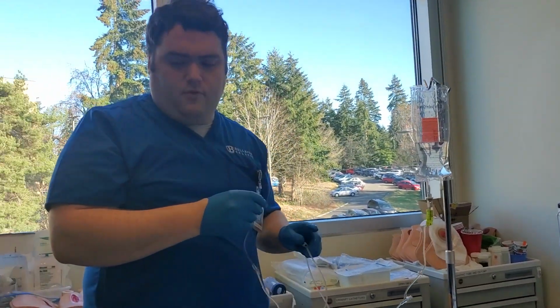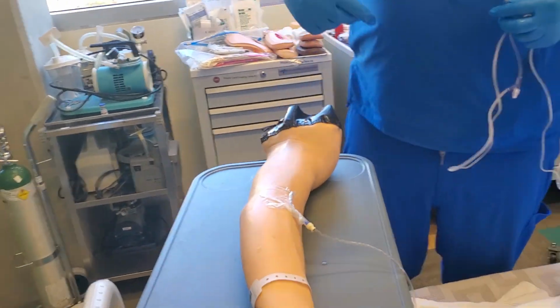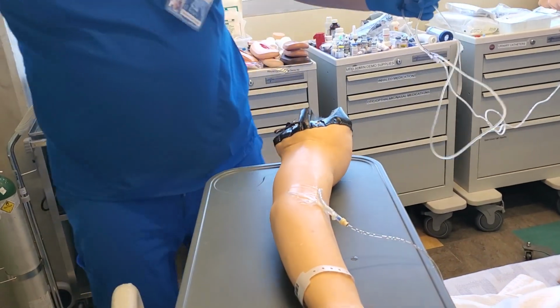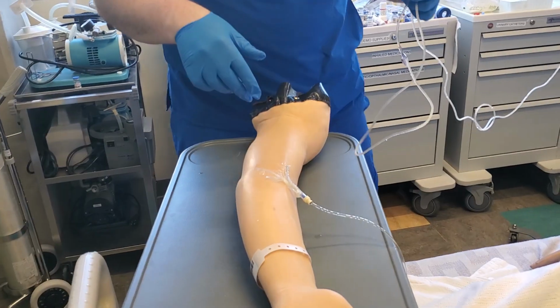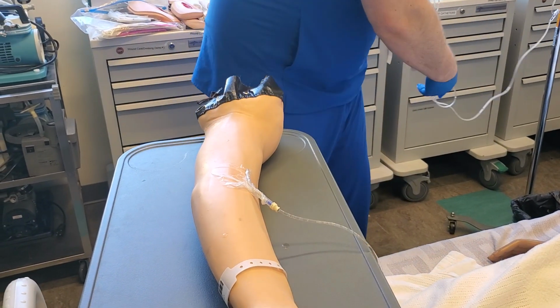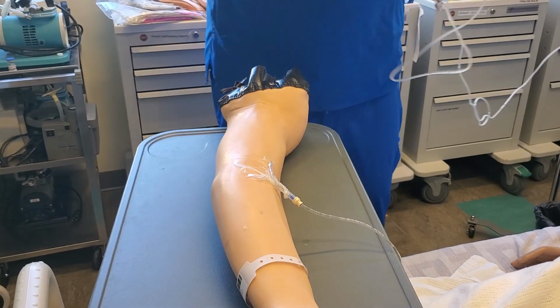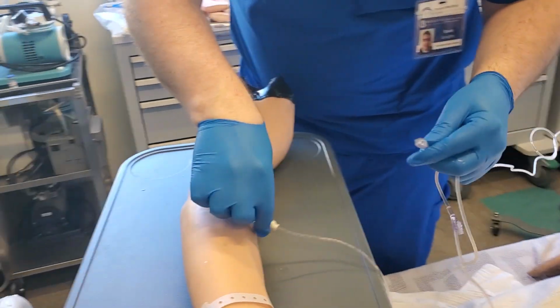Now we're going to go ahead and move over to the patient. We have already uncapped that. Say we'll just for good measure wipe it down, checking for infiltration, inflammation, leaking. So then we will go ahead, let me just check something here. So we'll go ahead and we will connect.